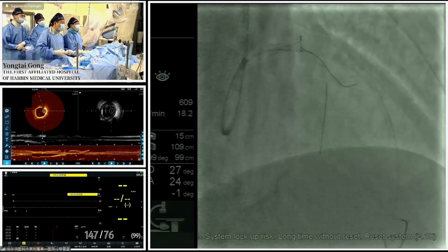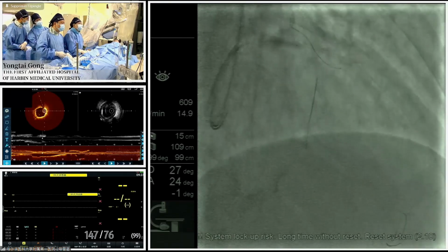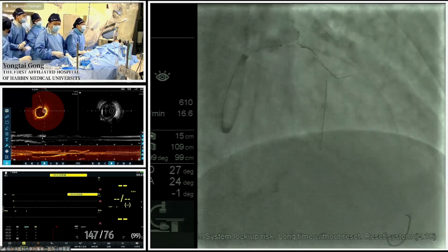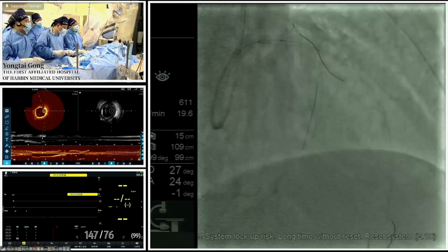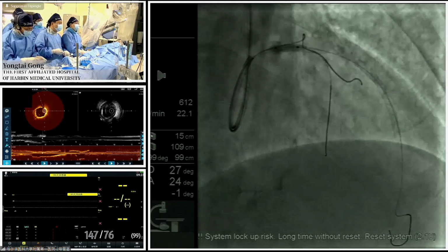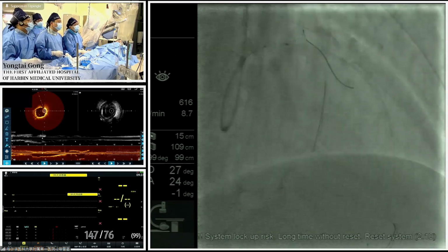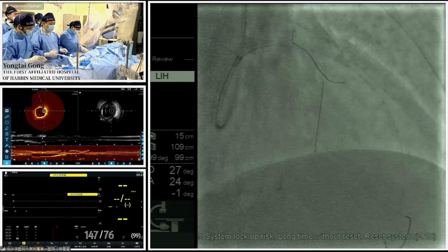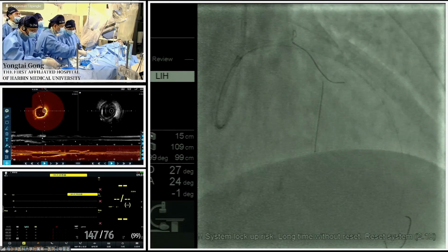Dr. Zhang, right now there's another problem. After the pre-treatment of this lesion, we have to put in stents. But the stent has to be placed from an area with a clear diameter discrepancy between the left main and the LAD. For this kind of situation, how do you usually choose the stent size? Oh, yes. There are two questions about the stent landing zone.